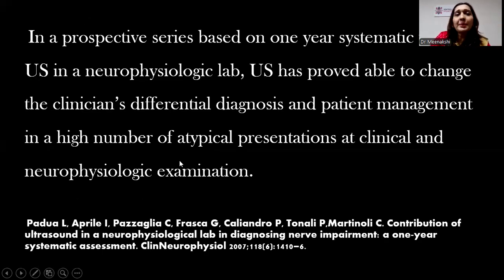In prospective studies based on 1 year of systematic use of ultrasound, it has been proved that it helps clinicians in solving the differential diagnosis and in patient management in a high number of atypical cases at clinical and neurophysiological examination. I will also be giving you some videos at the end of the talk of some of these atypical cases where ultrasound has really helped us to make a diagnosis.